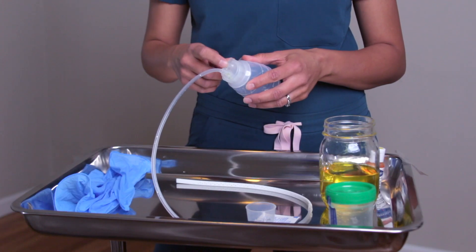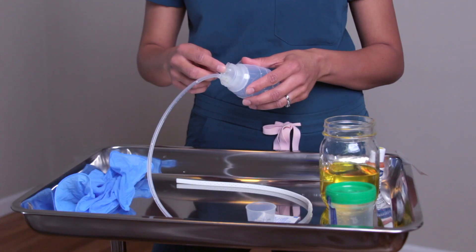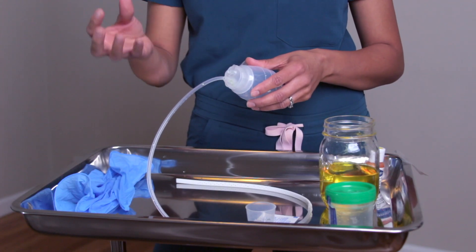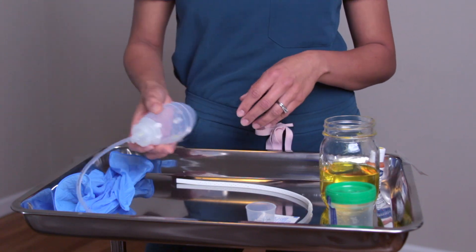Here you have your actual drain port, which allows the suction so it can control the contents of the fluid. Now let's talk about normal versus abnormal fluid. A patient that comes fresh out of surgery — you expect to see a bright red color fluid, which is completely normal. This is referred to as sanguinous. Then within the next 24 hours or more, it will convert to a light pink color, which we refer to as serosanguinous.